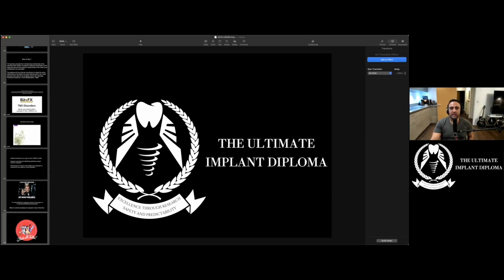It's when I see people who've done big premolars. Premolars are a big one, because premolars won't have enough space. You put one in, you cantilever another premolar. You haven't identified that these are key teeth on the bite, and hey presto, you're going to have problems. So identifying that comes down to your assessment of occlusion.